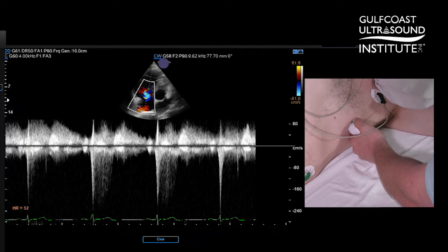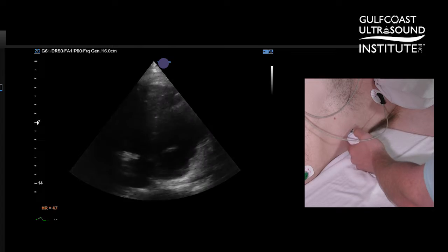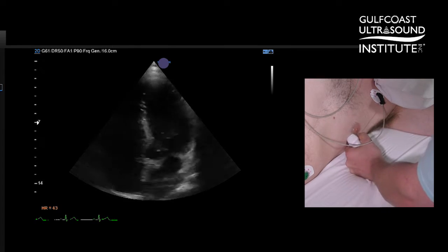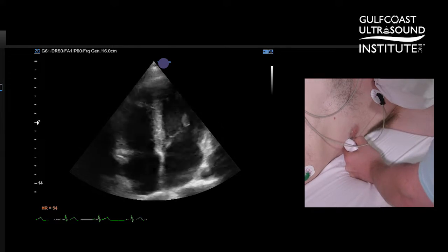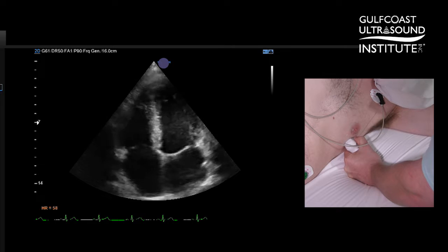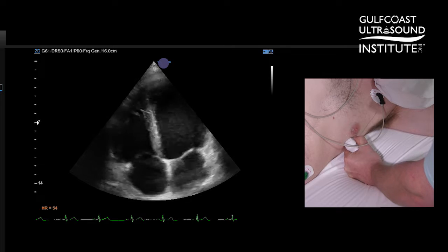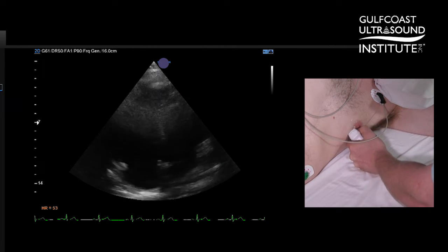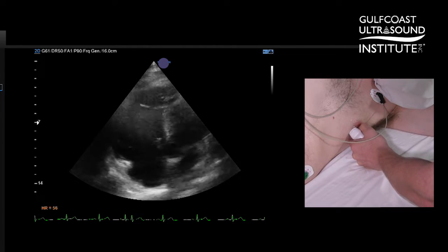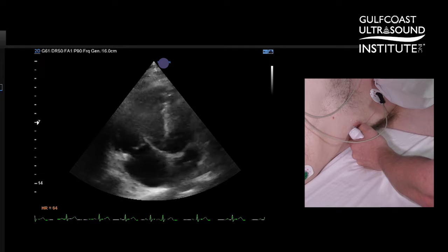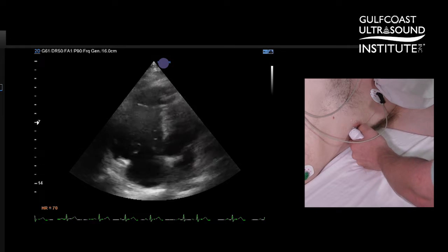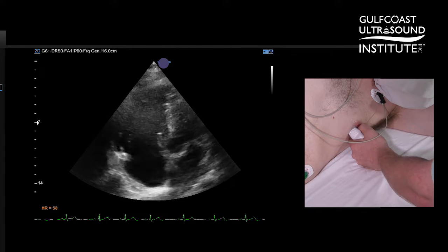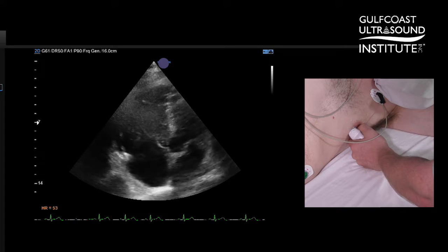One other thing to note from this modified apical four-chamber view: if we're at a standard apical four and come slightly off axis here, this is going to be the view that we want to use to measure our TAPSE.